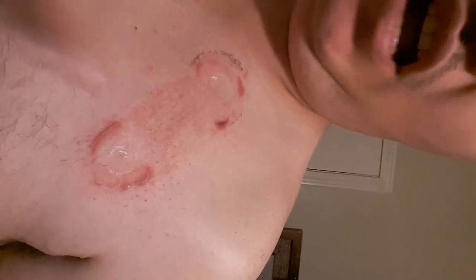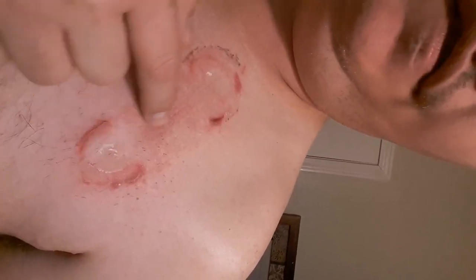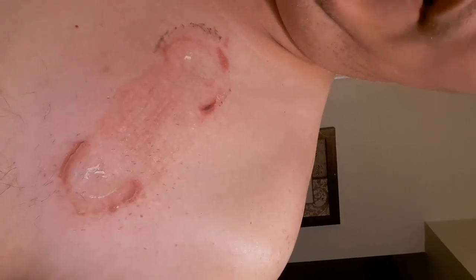Finished the test, pulled it off. I did have a little bit of a reaction to the skin, but it didn't come back off. It actually came off pretty easy, so not too bad. I was able to finish the test.